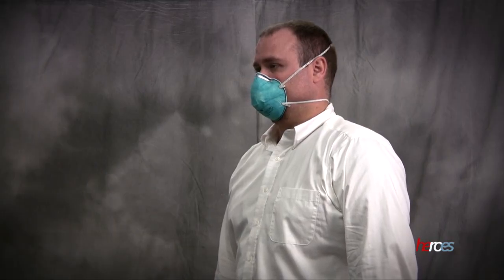Facial hair will prevent the respirator from making a tight seal with the skin. Even a small amount of stubble will compromise the seal and reduce the protection provided by a respirator.